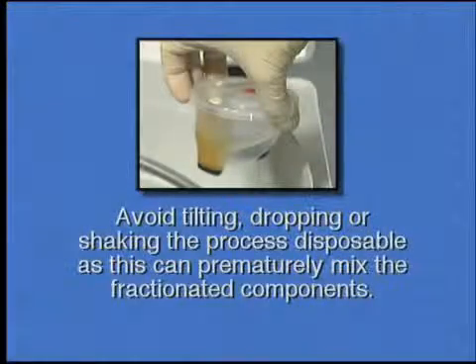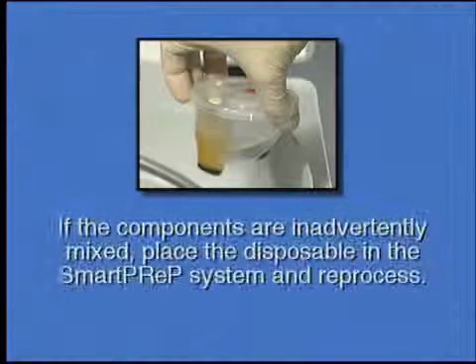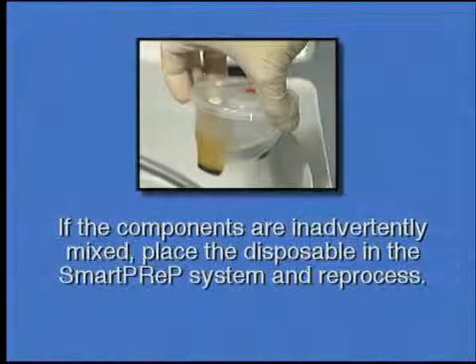Avoid tilting, dropping, or shaking the process disposable, as this can prematurely mix the fractionated components. If the components are inadvertently mixed, place the disposable in the SmartPrep 2 system and reprocess.